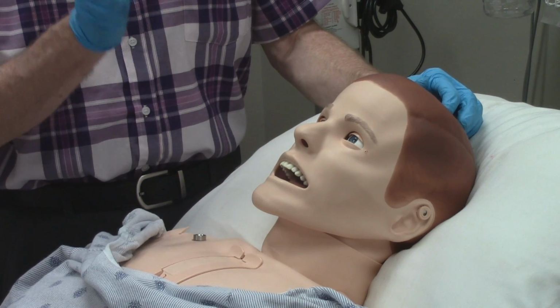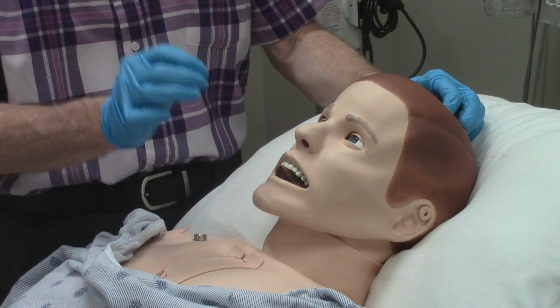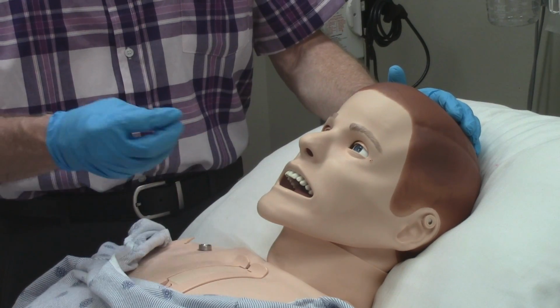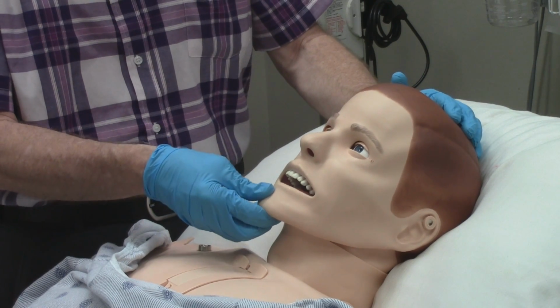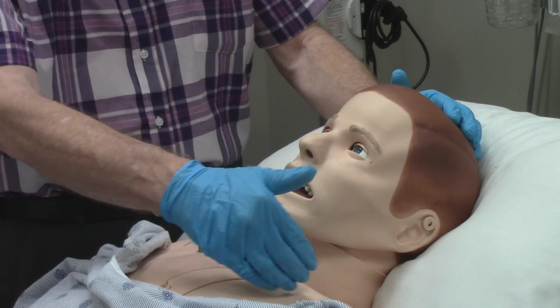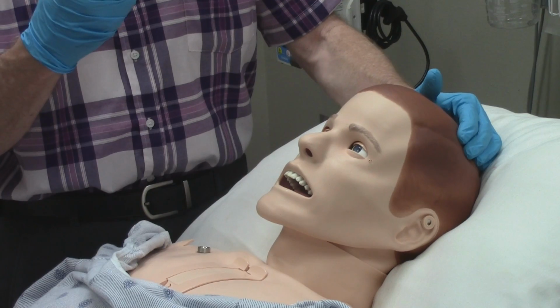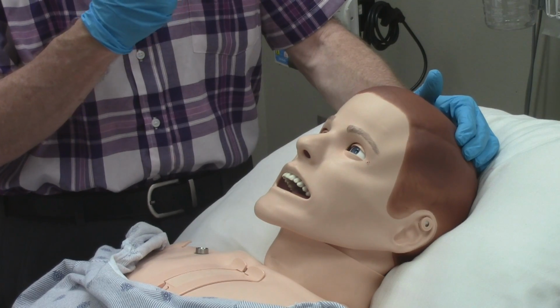We also have hard tooth inserts that can go into the mannequin that will actually break like a real patient's teeth. So please do not pry back on them. The patient has difficult airway features to make airway access more challenging. The mannequin can display trismus, so the jaw will clench, the tongue will swell, the pharynx can swell. We can decrease the range of motion of the mannequin's neck to simulate cervical arthritis. We can cause the patient to have a laryngospasm where the vocal cords will snap closed together.